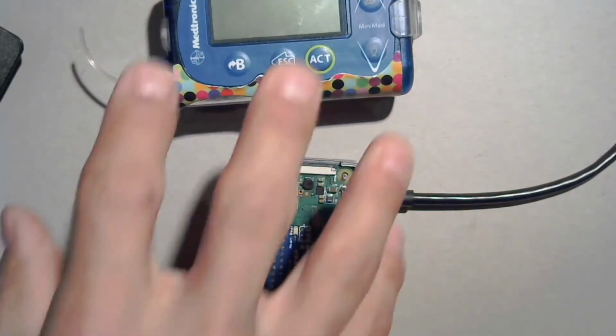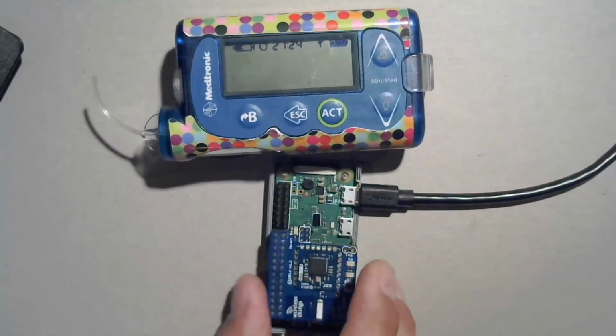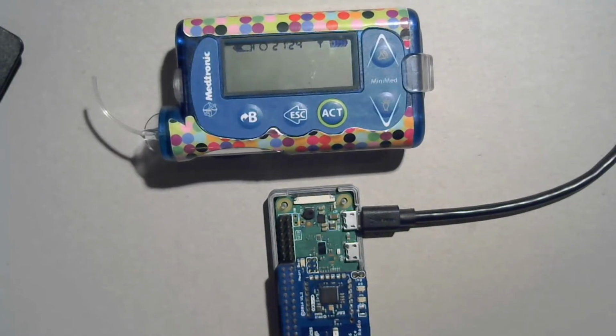So, I think I'm probably going to stop the stream now. The next thing that I'm going to do is actually pull this code into the Nerves firmware and do the work of trying to figure out exactly how to set the system date and time using a date that I actually have here. So I've been able to pull it from the pump, and now I'm going to try to get the system to use it. But I'm kind of getting tired of streaming, so I'm going to call it. Thanks for joining with me.